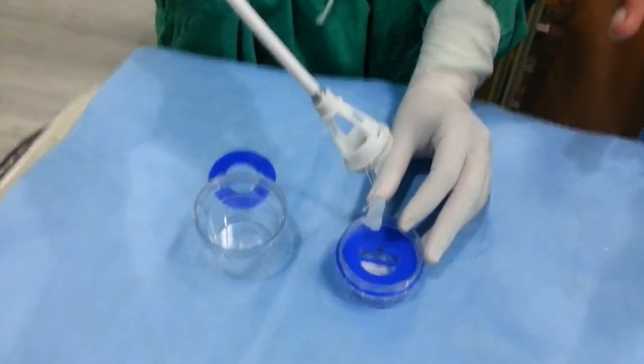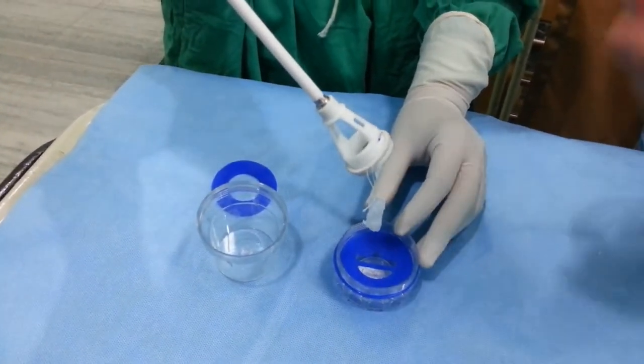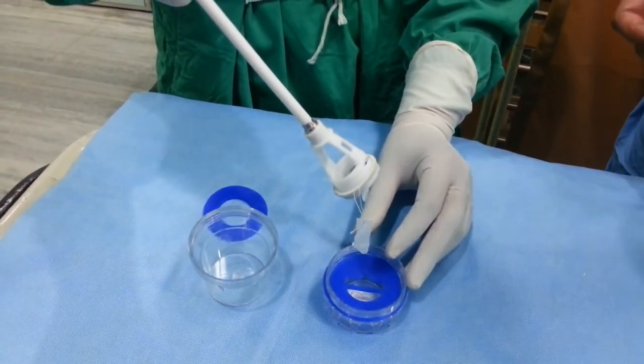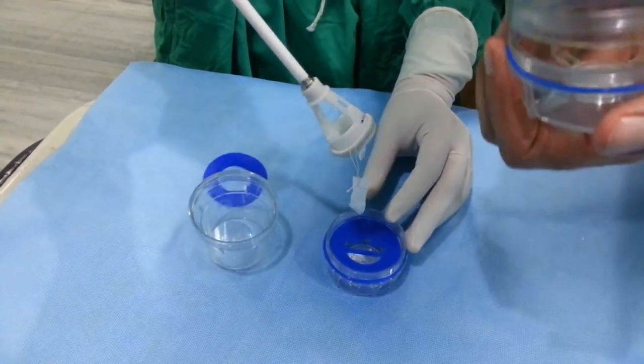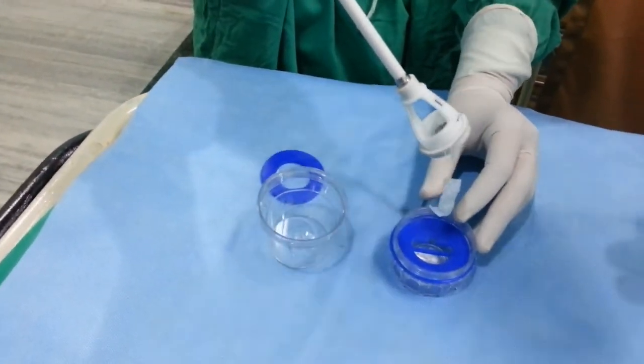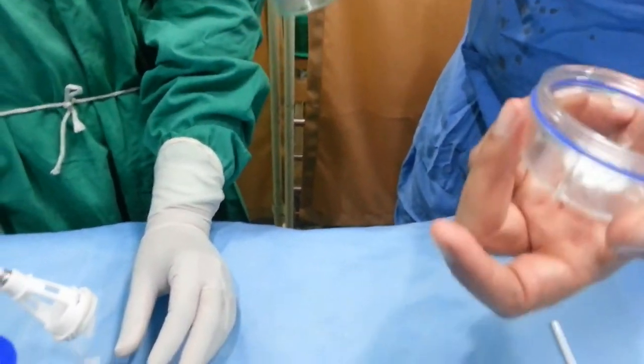So please remember, all holding of the short part is with the left hand. This unsterile nurse also holds with the left hand and opens with the right hand. The sterile nurse also holds with the left hand and opens with the right hand. These are the important things. Don't shift your hands. It makes it easy to give the valve.